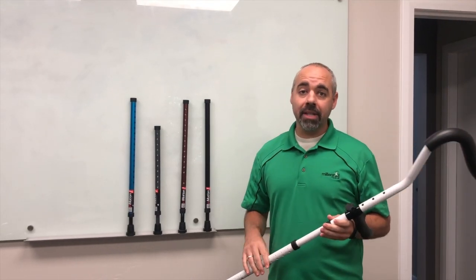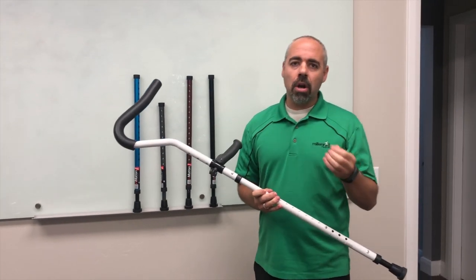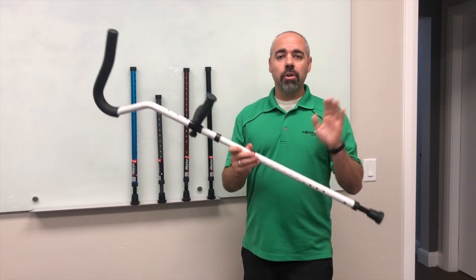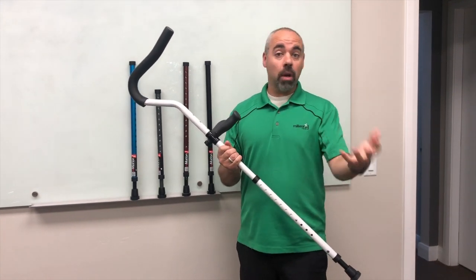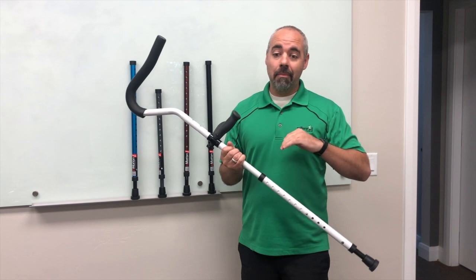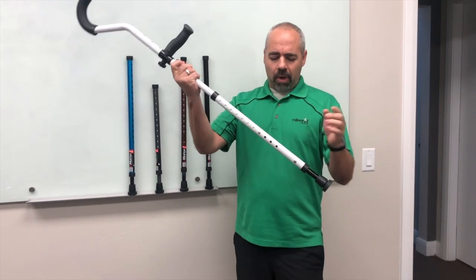We're back with another quick tip for your In Motion Pro crutches. Just like your car tires need rotation, your lower posts need to be rotated too. You'll get better life — that's what our customers have told us: they last forever when you rotate them.